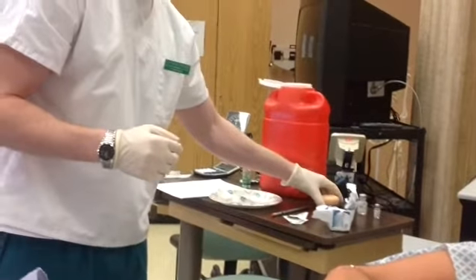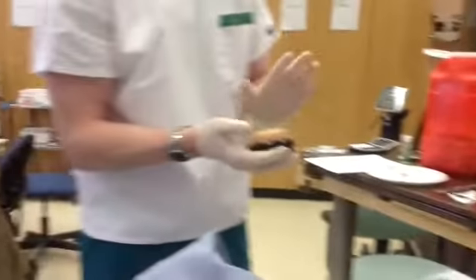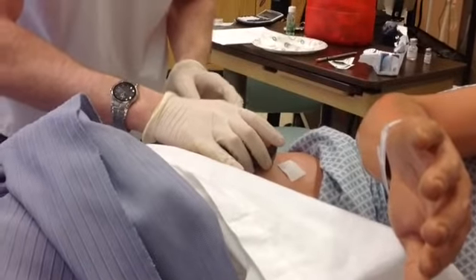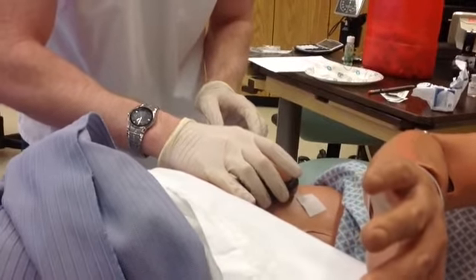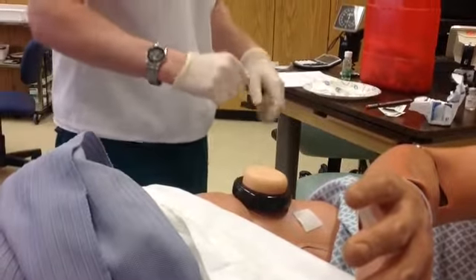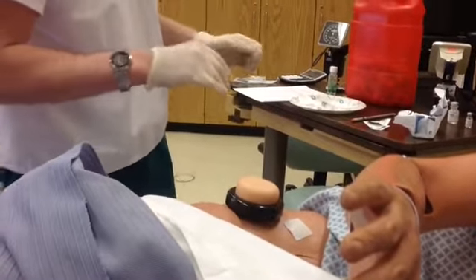And for the purposes of this video, we're going to use this as my injection site. Okay, so that's all cleaned off, wiped off.